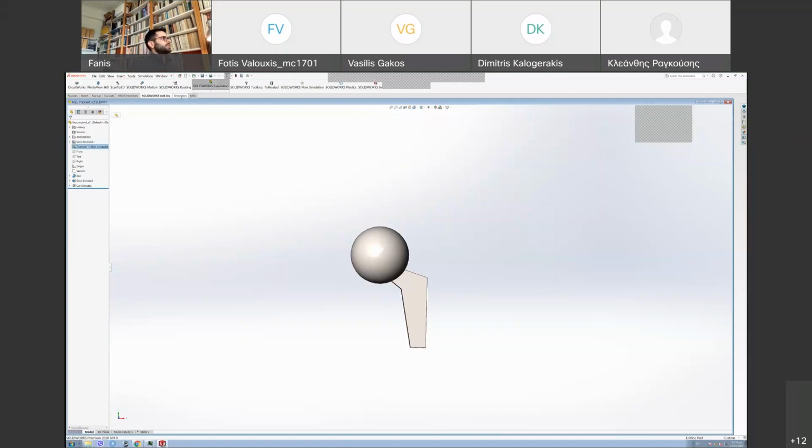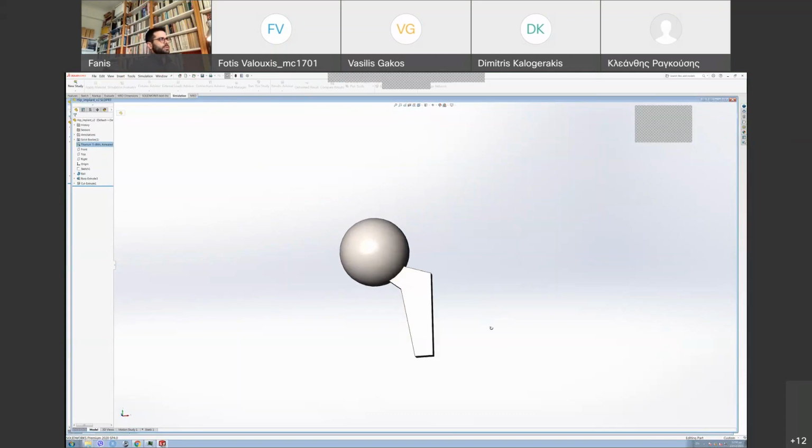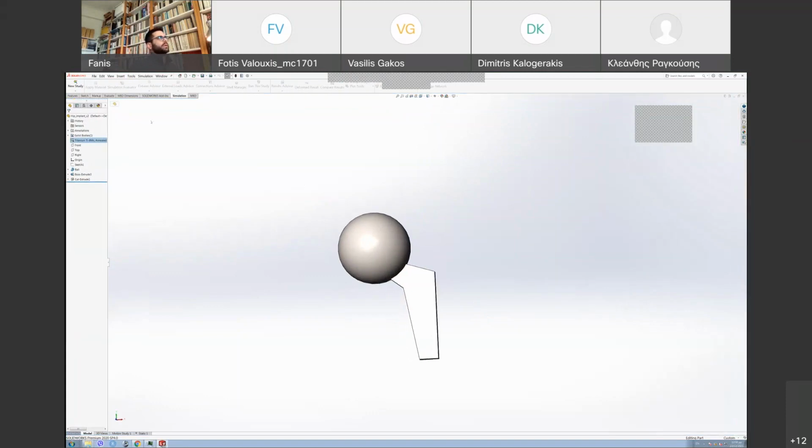Okay, so it loaded. So you now go to SolidWorks simulation. Sorry, let me maximize this. You go to new study. Now you can choose several studies. You will choose here static. Okay, so it's static study. For me, static two, because I already have one.